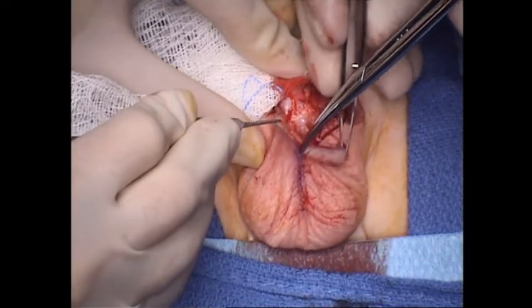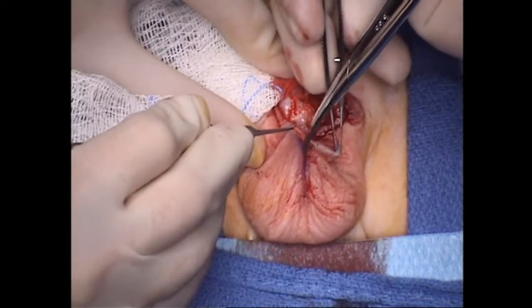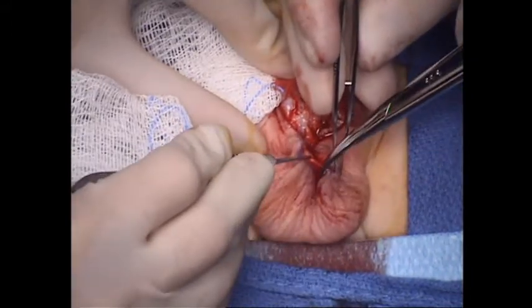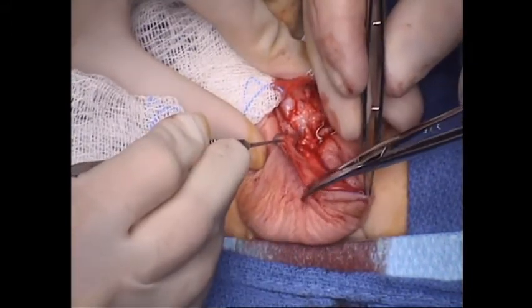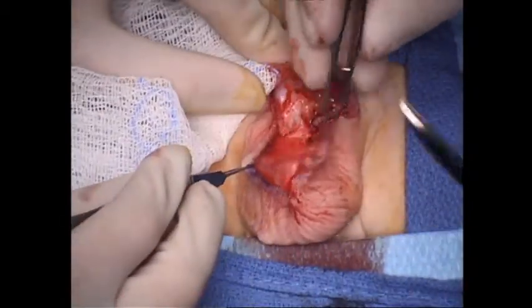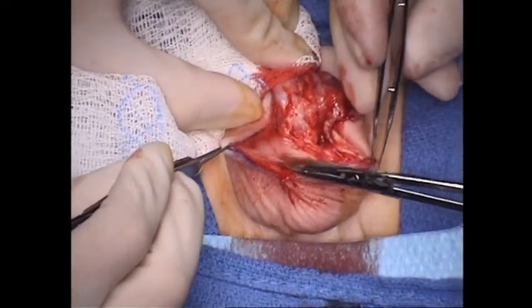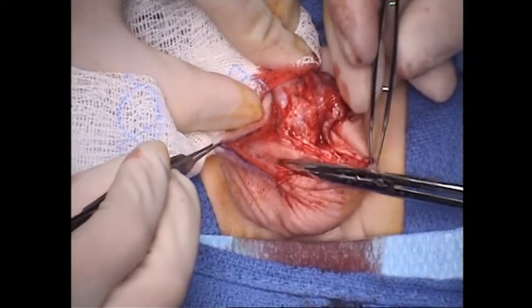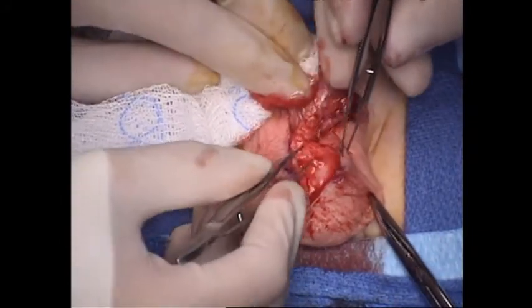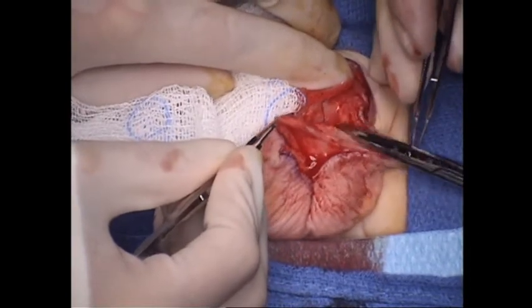You will see why shortly that we open the scrotum up like this. Now, in some cases of proximal hypospadias, there's a big cleft of the scrotum, and that needs to be removed. In this case, there isn't that cleft, but we will be dissecting deep within the scrotum in a few minutes, and we'll need this exposure. In fact, if anything, we may find ourselves opening it up even further than what we started with here. There's invariably a few little perforating blood vessels, and so we'll stop to get some hemostasis here in a second.